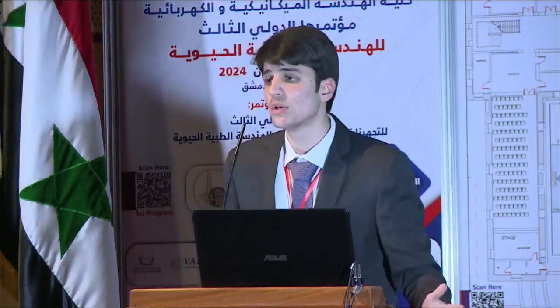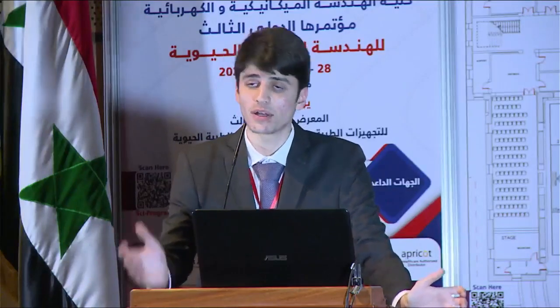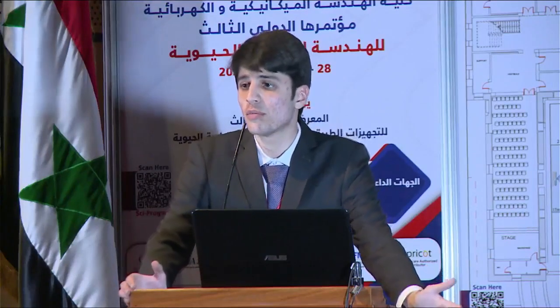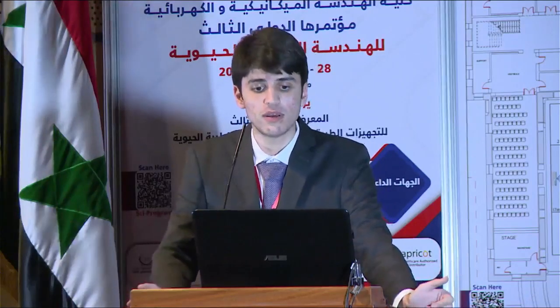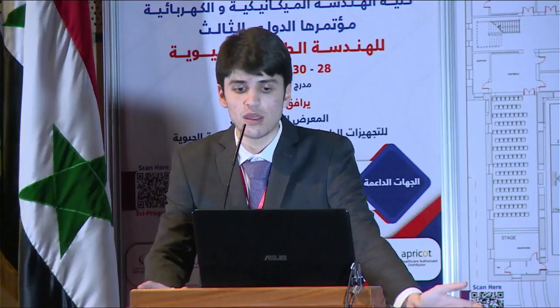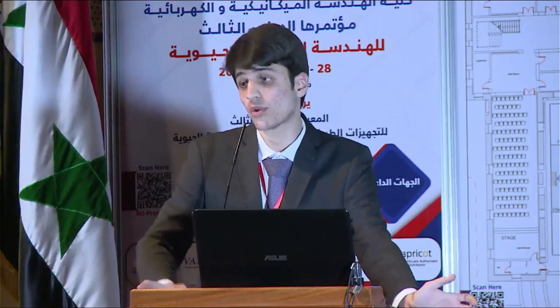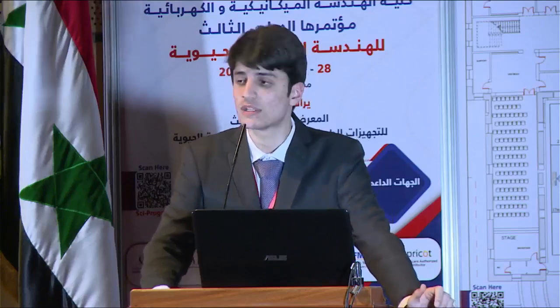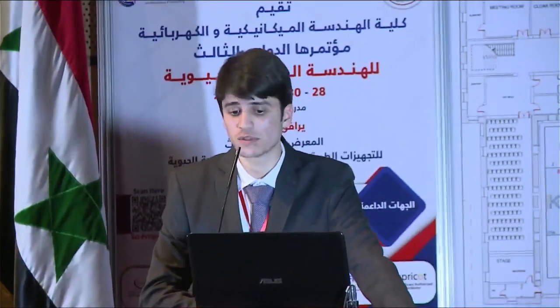Finally, the future prospects: we decided to take advantage of artificial intelligence to make our prosthetic limb more suitable for the market, more affordable. We decided to use the topology optimization method for the thickness effect, and finally the multi-objective genetic algorithm for the best selection of the material. And here we have the references. And thank you.